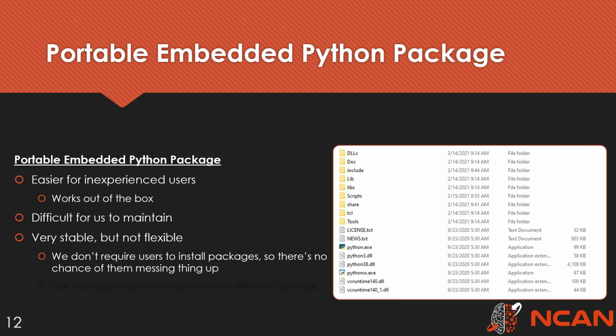But the nice thing about this package is that it's going to work on most Windows installations, both 32 and 64-bit. Because we have already configured all the dependencies and matched them to work with our BCPy2000 dependency, we can be somewhat certain that it will work without much messing around.